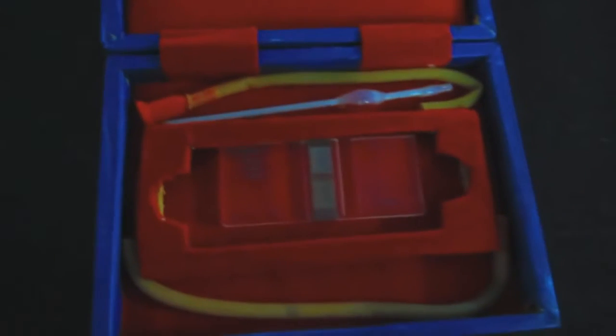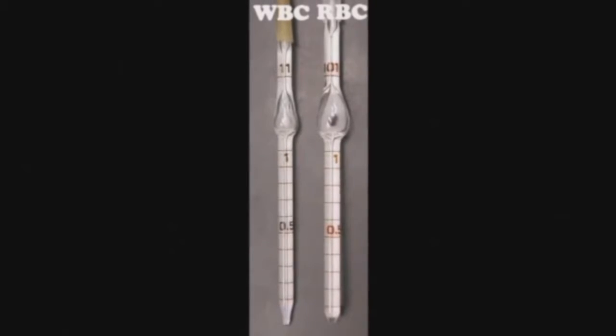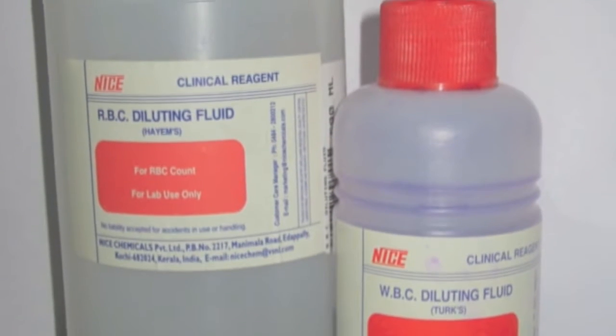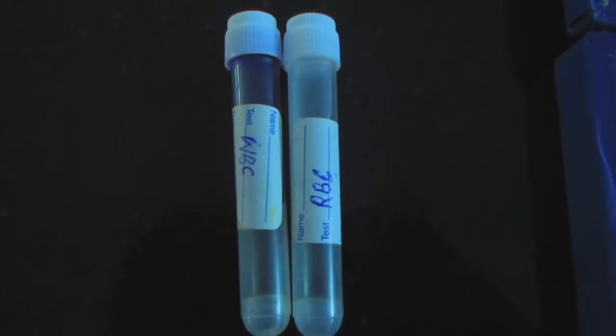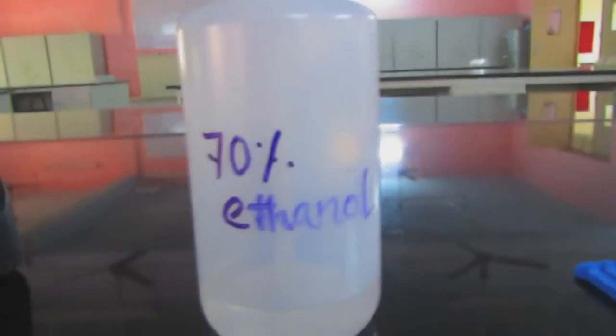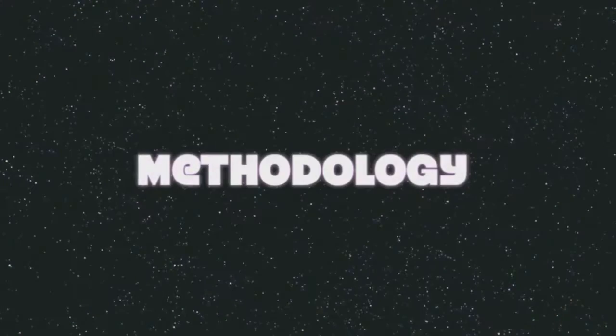Materials required. The materials required are a hemocytometer, RBC and WBC pipette, RBC and WBC dilution fluid, pricker, 70% ethanol and a microscope.